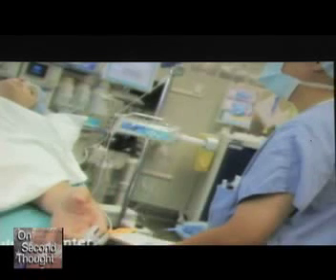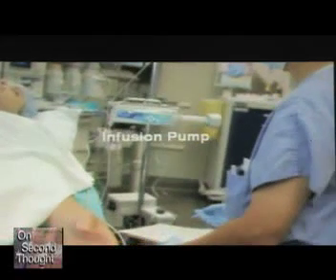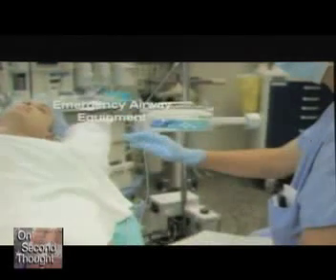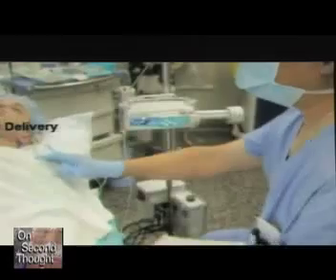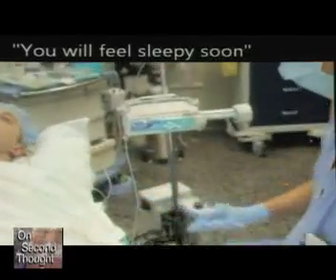Please continue. And then I'm just sort of showing a couple other things here. This is the infusion pump that's all set up to the patient and ready to go. The emergency airway equipment is back here on the cart. You can see how close it is to the patient. It's right here, organized and ready to use. Please continue. And you can see the patient has the nasal cannula in place right here. That's so that the patient is receiving additional oxygen and providing carbon dioxide monitoring.